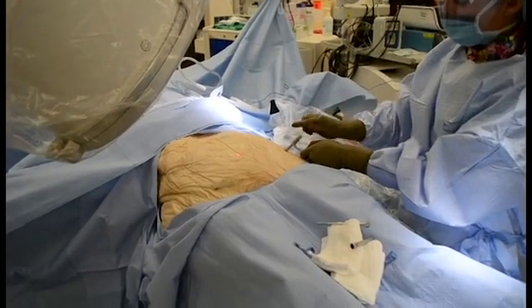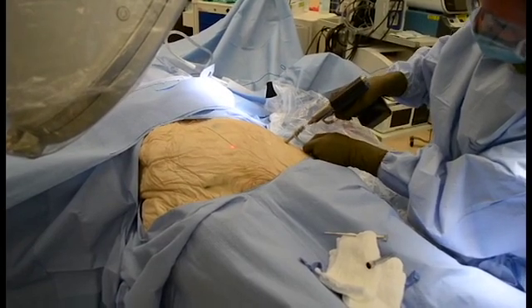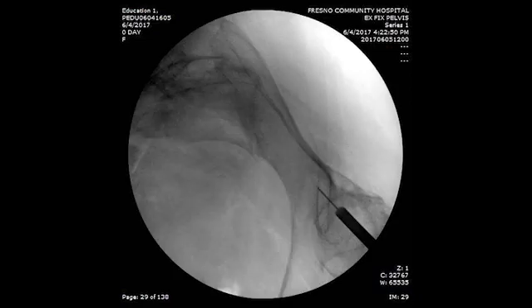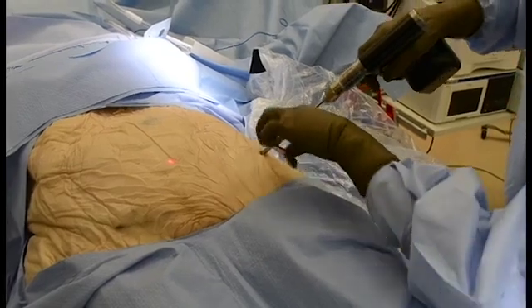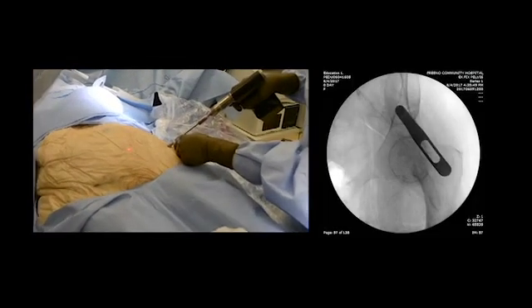The X-ray tech can mark C-arm angles to allow quicker return to the correct position. Because of the shape of the AIIS, the drill has a tendency to slide medial or lateral. This can be avoided by first using a 1.25 K wire with a cannulated drill. A more caudal start point will help prevent skiving. Confirm start point with fluoroscopy using the teardrop view, which correlates to the external and internal iliac walls, also known as the obturator outlet view. Second view with the obturator inlet to confirm trajectory — advance K wire 1 cm. Then obtain your third view with the iliac oblique to ensure you are out of the sciatic notch and pointed toward the PSIS; adjust cranial to the sciatic notch for your trajectory and advance K wire 2–3 cm to secure a start point. Remove the inner sleeve and insert the cannulated drill. Repeat obturator inlet, obturator outlet, and iliac oblique views. Then insert the 5 or 6 mm diameter Schanz pin through the guide to the posterior ilium for best bone purchase.